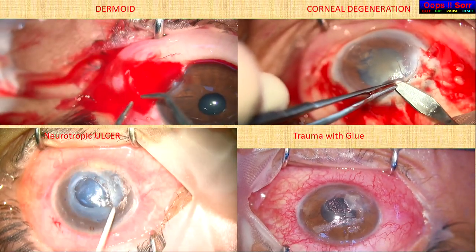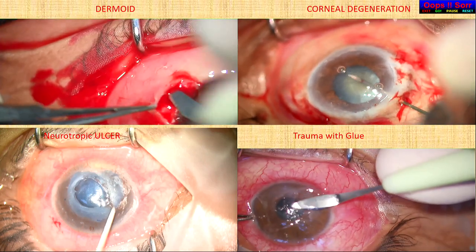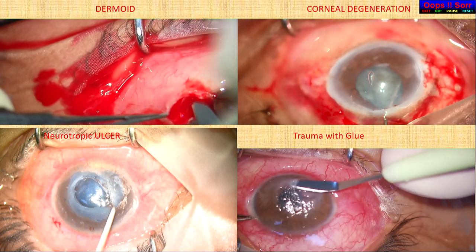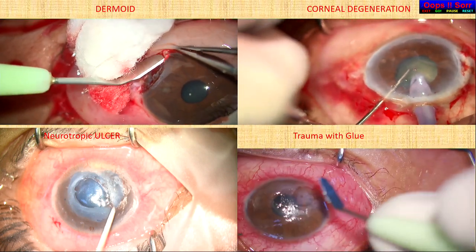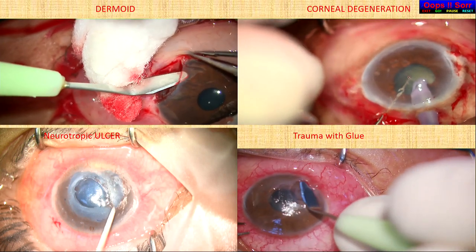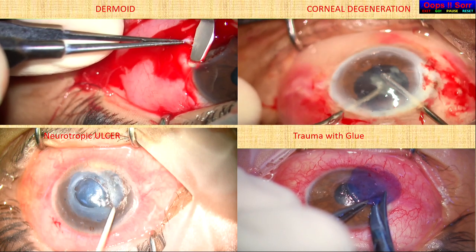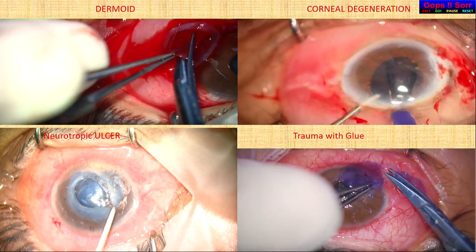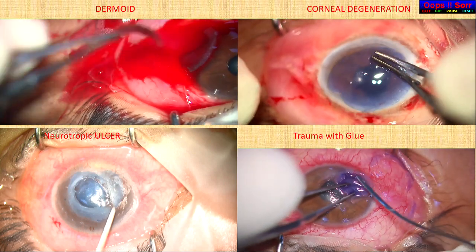On the lower side, there was a case of trauma repaired with glue elsewhere. The AC was collapsed. We removed that glue and put this lenticule. The visions are generally 6/9 to 6/6. We have done 12 cases, and one of my students has presented this series today also.